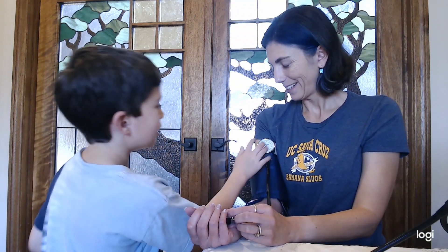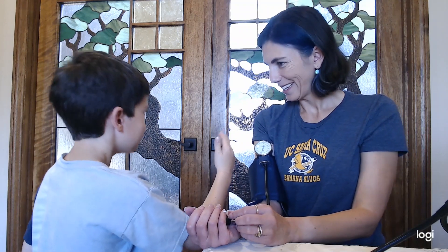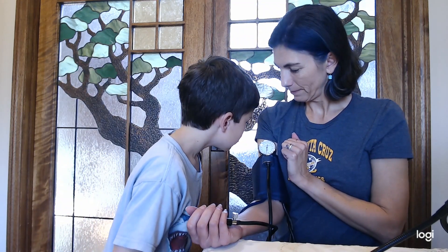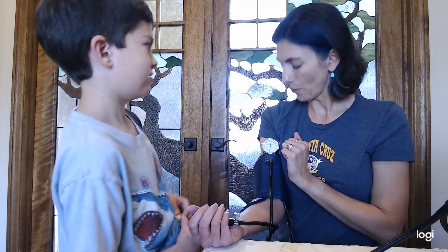So it started at 140 and ended at — wait, it ended in like the middle. Oh, it was like 65. So 140 is when you first heard the sound? Yeah. Thank you.